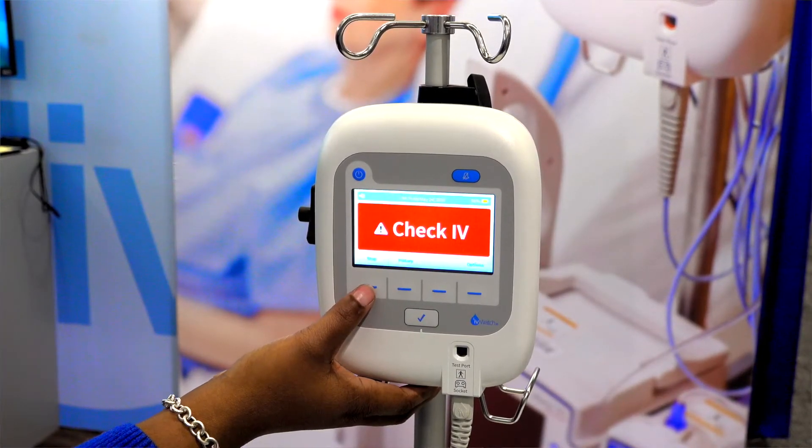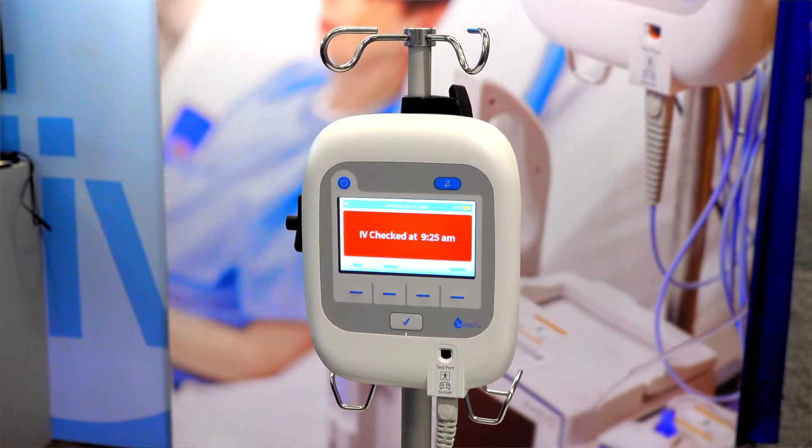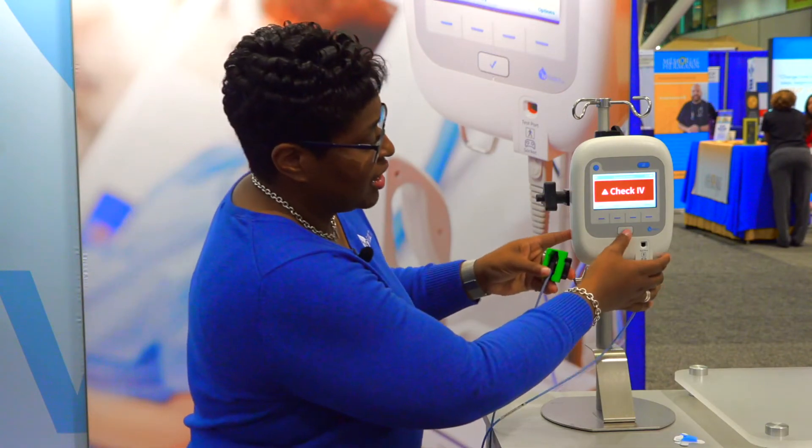If the system senses that the condition has worsened from that yellow alert, it will give you a red alert, at which point monitoring will stop. You can see the time and date stamp — it saves in the monitoring history. If the situation continues, you will get that red alert, monitoring stops, and that is your signal to come over and really assess the IV site, because chances are there is an infiltration. The red alert signifies that there has been such a drastic change from the initial baseline that something is going on.